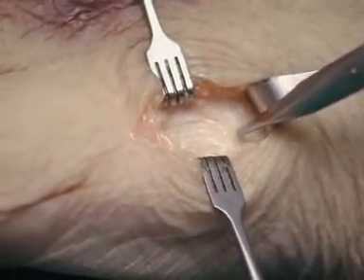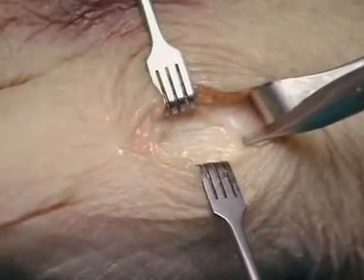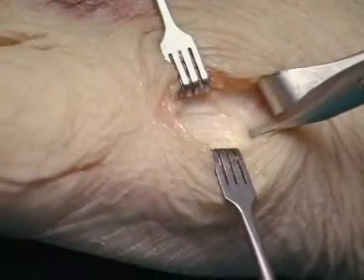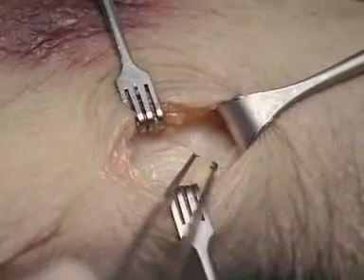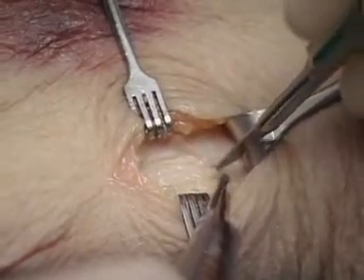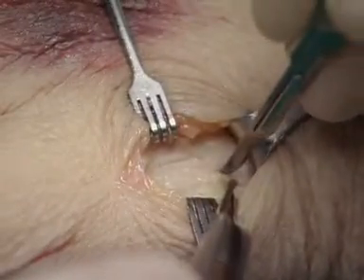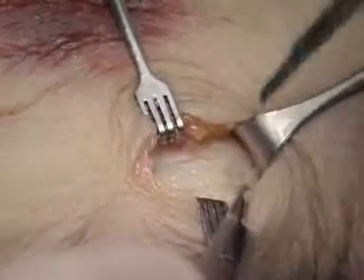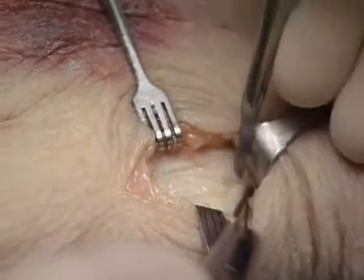The position of the saddle joint is determined. The incision of the periosteum is extended in the proximal direction as an arthrotomy, and the joint capsule is reflected radially and ulnarly.